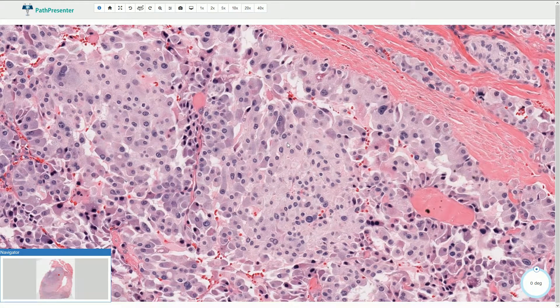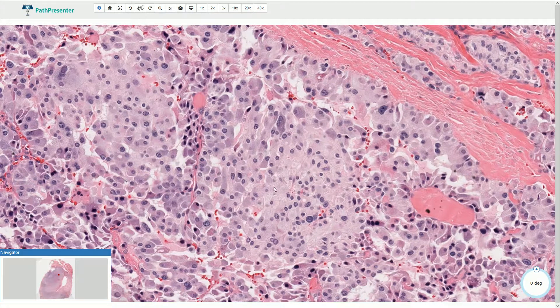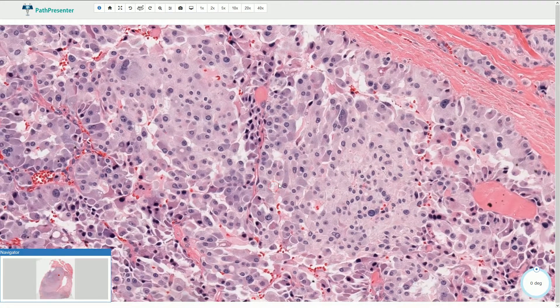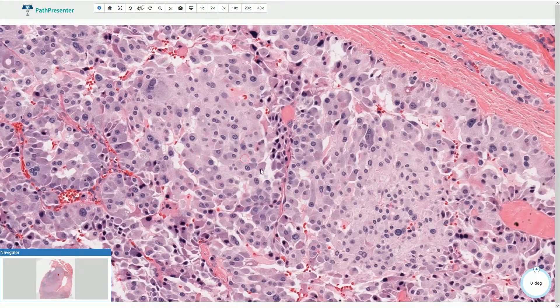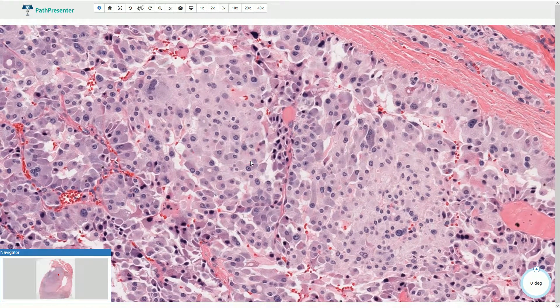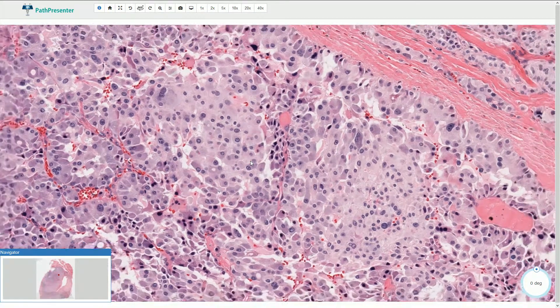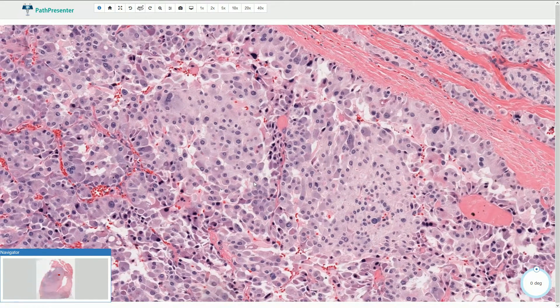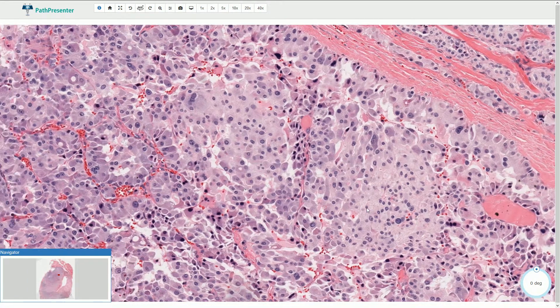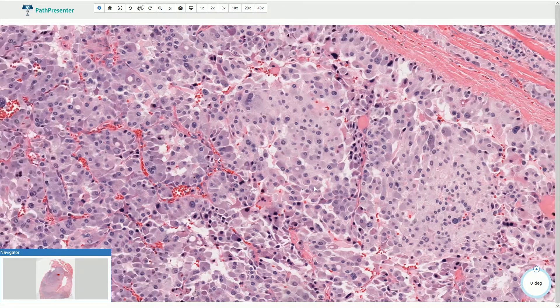Some of the cells have darker cytoplasm and some have lighter cytoplasm, but the granular appearance due to the content of neuroendocrine granules is quite characteristic. The cytoplasm is typically voluminous and granular. We can also see the solid arrangement of cells, or solid type of growth.